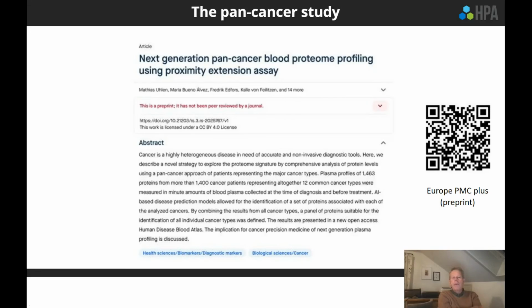So instead of calling in people maybe every 10 years or so, you might then want to do a simple blood test every year to actually select those that should come in for a proper mammography if it's breast cancer, or a lung scan if it's lung cancer, and so on. Yeah. So this would then solve this really big dilemma that I talked about, the false positive dilemma.